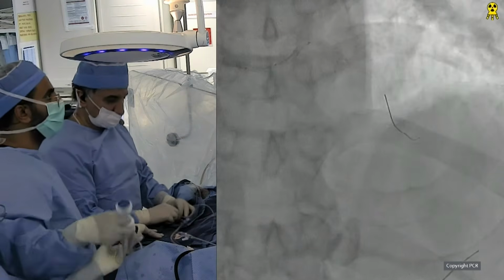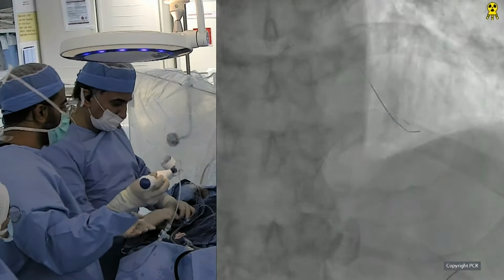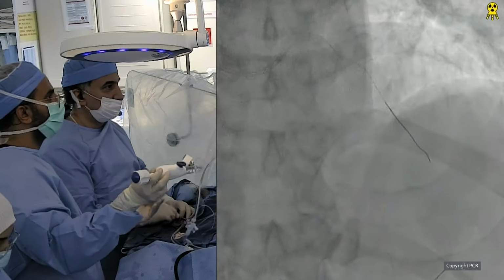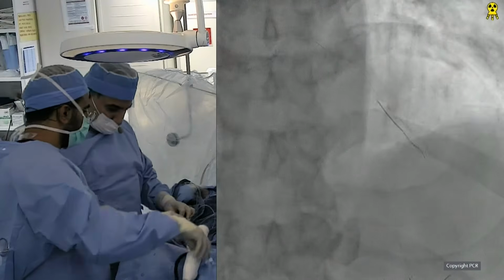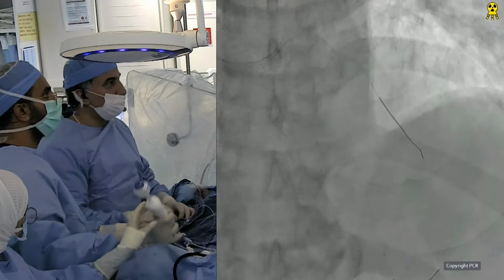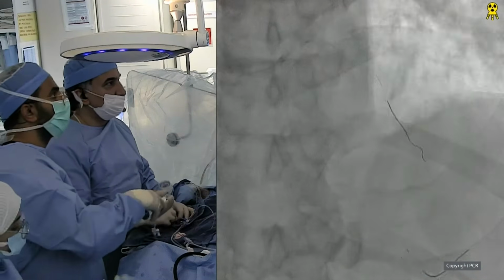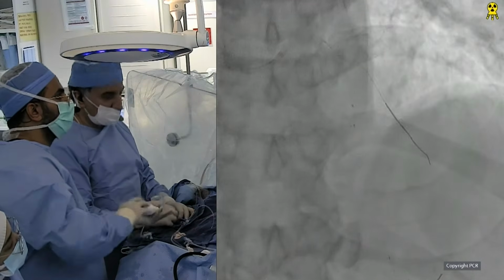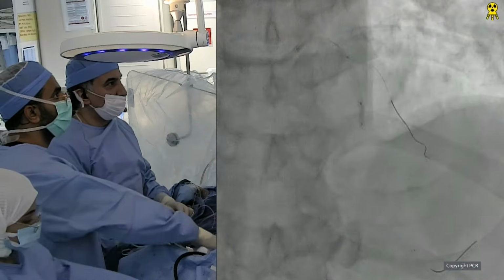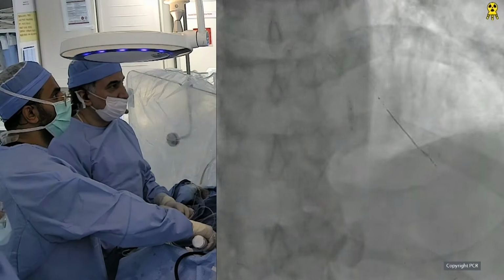My question to you, Giulio, is out of the OCT, would you deduce that there is a role for further ablation, for further rotablation, or maybe something else that creates a larger lumen? So the most important thing was to go back and see that these cracks and fractures were made systematically along the way. And in fact, the balloon was fully open. So watching the balloon is very important after the preparation. So I don't think we needed too much in addition.